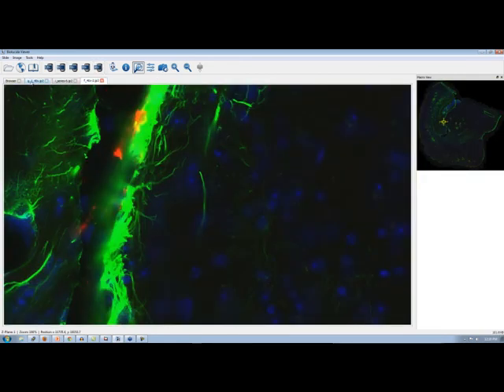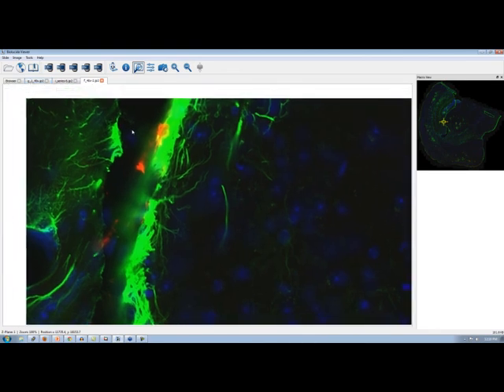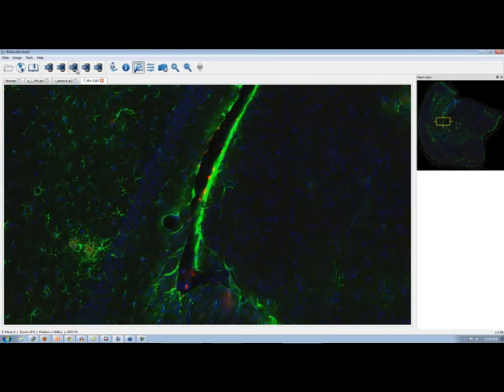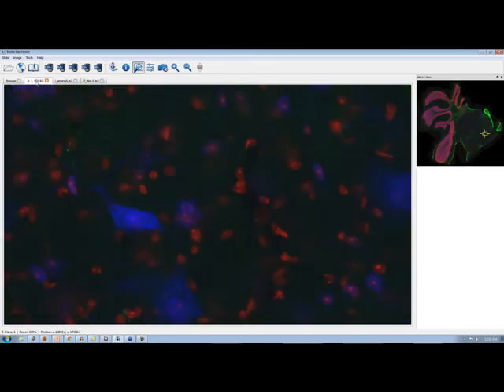So the image was generated at 20x, and then the software generates these other kind of like virtual objectives so that I can look at this image at 10x and 20x, or I can't actually, 10x, Exactly. 5x, 2.5x. Exactly. So, and those are specific to each image itself. Sure. Okay. So that's one way that you can use zoom around an image.